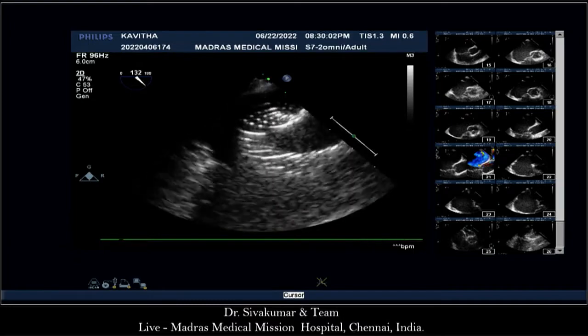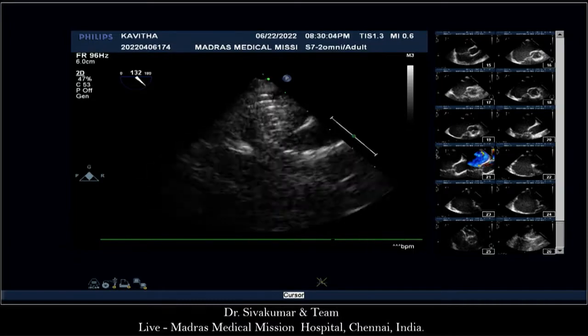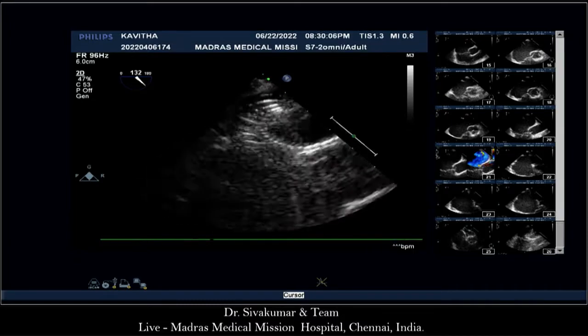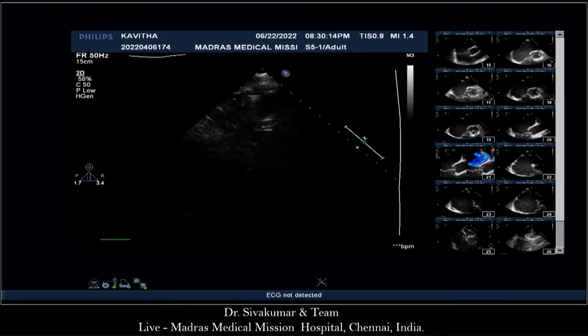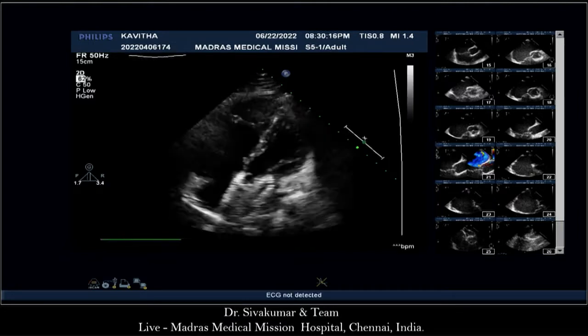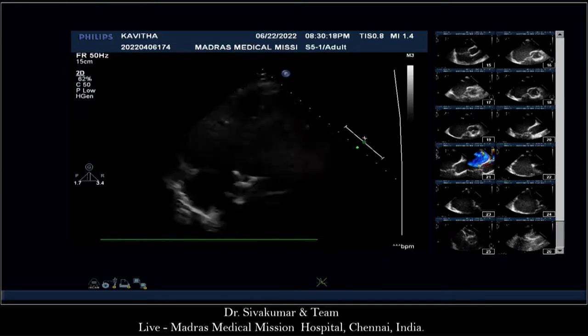And one of the ways to do that is when you're at 0 degrees view, when you don't see the aorta, you pull back the transducer of the transesophageal echo, and when you pull back, you start seeing the aorta. So you go from the coronary sinus, which is the posterior-most structure, to the aortic valve. That's the way you can look at the whole excursion of it, and that's what you want to see here.